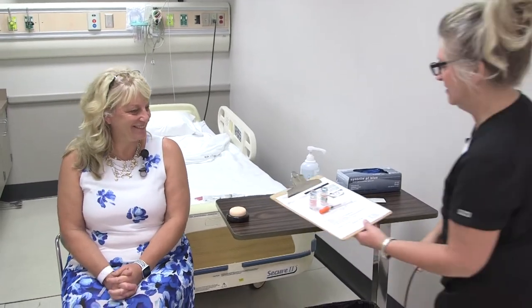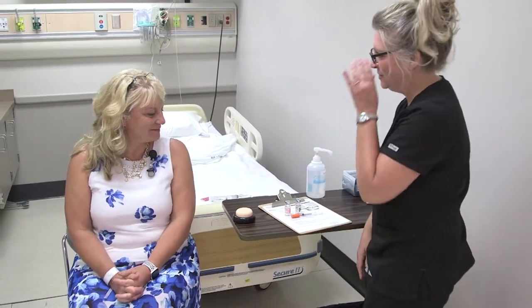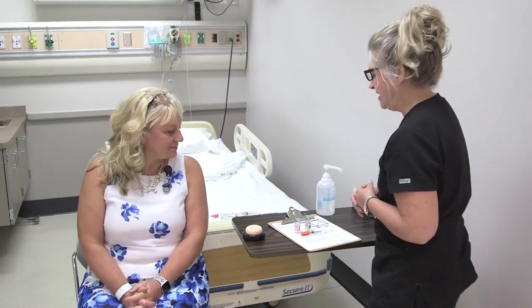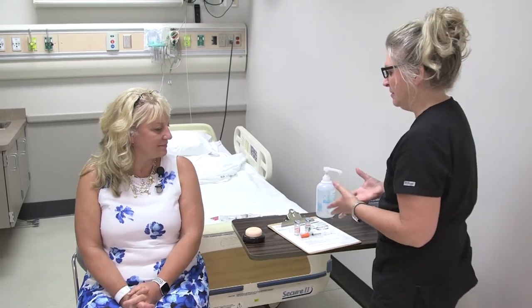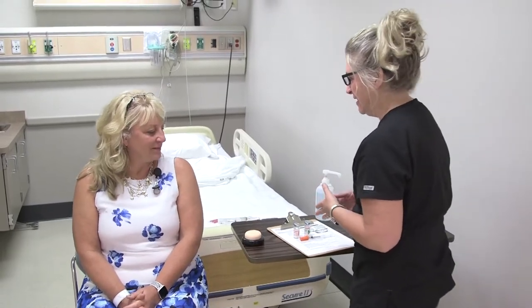Hi! Hi Sylvia. My name is Mary. I'm a student nurse with CBTC and I'm going to be here giving you your insulin this morning. Okay?